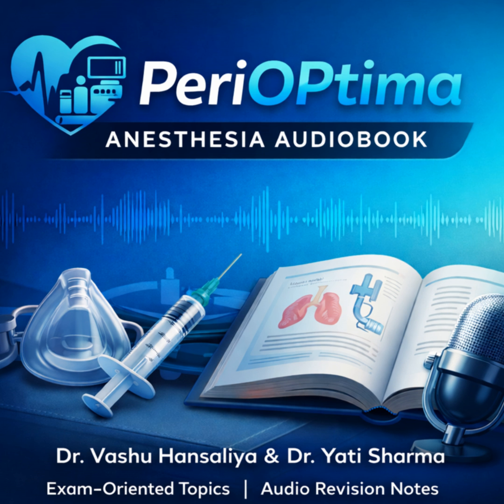Right. SIMV was designed as a sort of hybrid solution. You still set a mandatory rate, let's say 10 breaths per minute. The machine guarantees those 10 breaths will be delivered. Well, what's the key difference from AC? The key difference is what happens between those mandatory breaths. In SIMV, the patient is free to breathe spontaneously on their own. And those spontaneous breaths are not full machine breaths. They are just whatever volume the patient can pull on their own power.